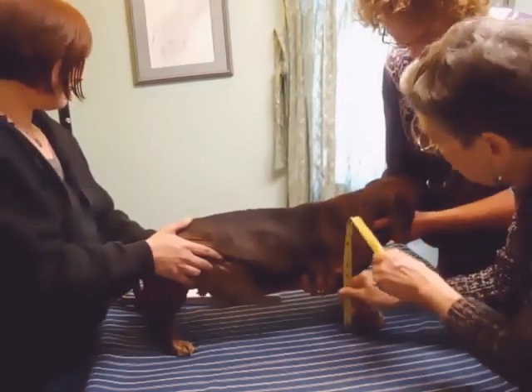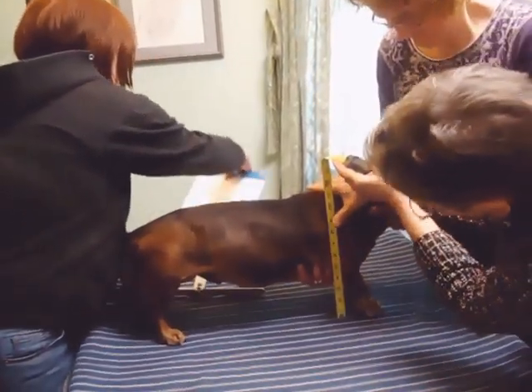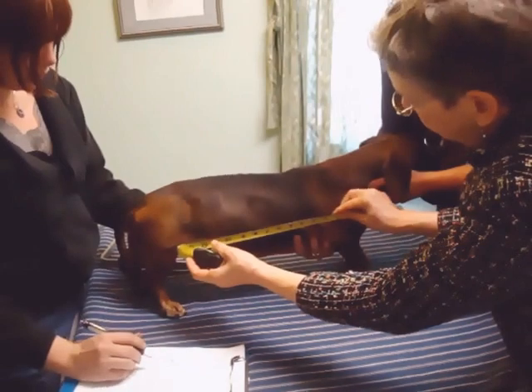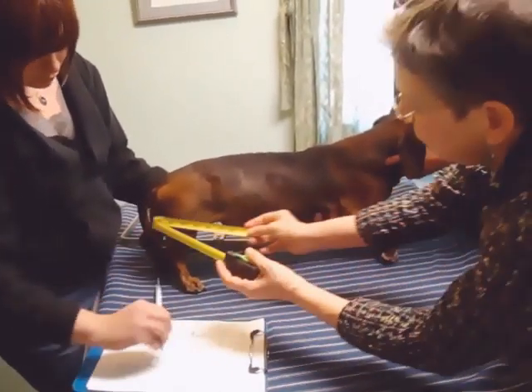For measurement A, you put your hand on the dog's scapula and measure to your hand — the number is 11. For B, you go from the center of the shoulder to the front of the thigh, and we have 13 and a half.